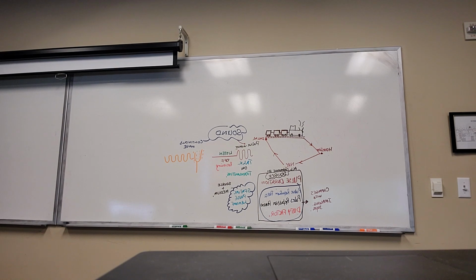But when I change my depth of view and now I'm imaging the kidneys, which are right here, posterior, it has to cover all this ground, and that's another way of saying there's a change in my imaging depth. It was superficial, now it's deep. That will affect those three bottom parameters, but not the pulse duration.